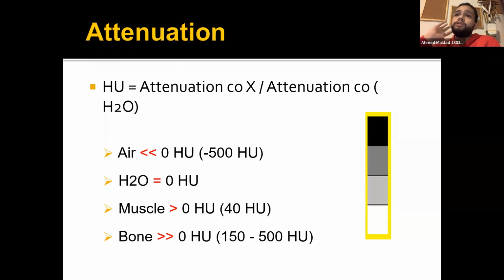All right, now this is the different part about this lecture. This is what's different between CT and X-rays, the attenuation, all right? And by attenuation, I mean how differently different parts of the body absorb the X-rays. And in CT, we measure it by the Hounsfield units or the HU, right? You can't say HU units because the U is units, right? So your benchmark is water, which is 0 HU, right? This is where you start.